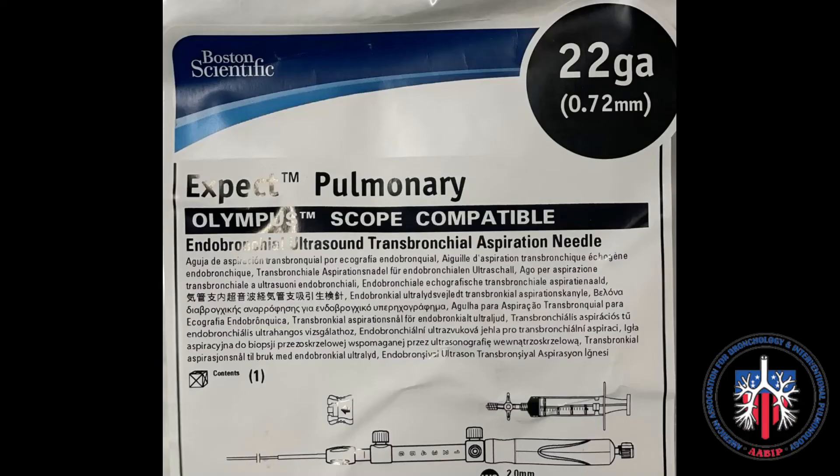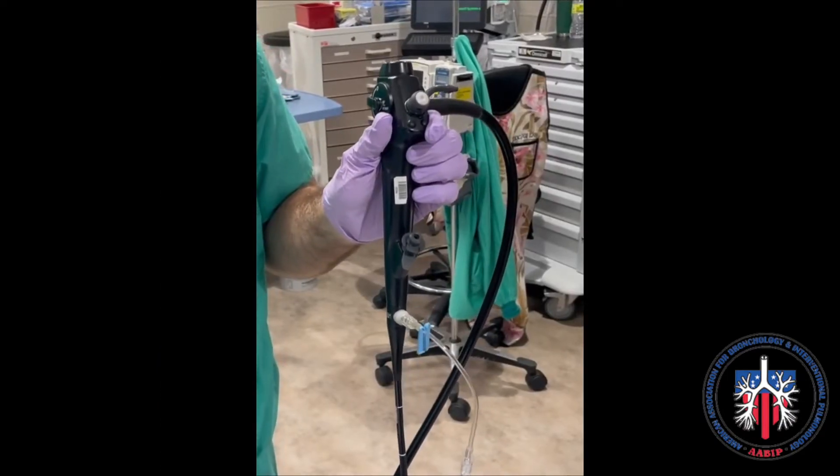The steps of use for the Boston Scientific Expect Needle are demonstrated here.